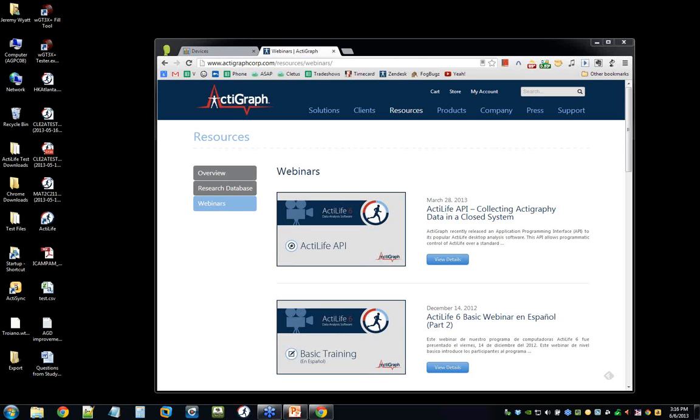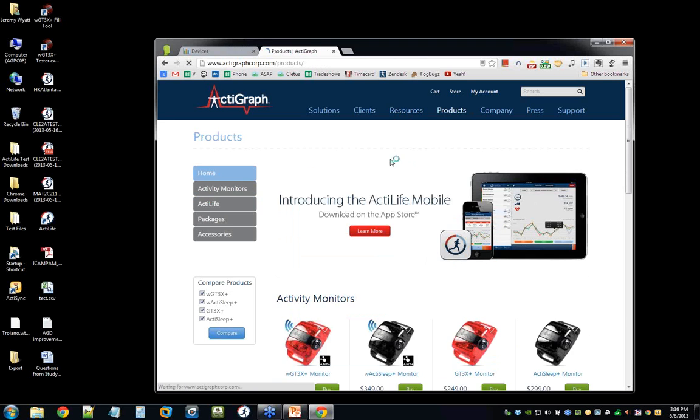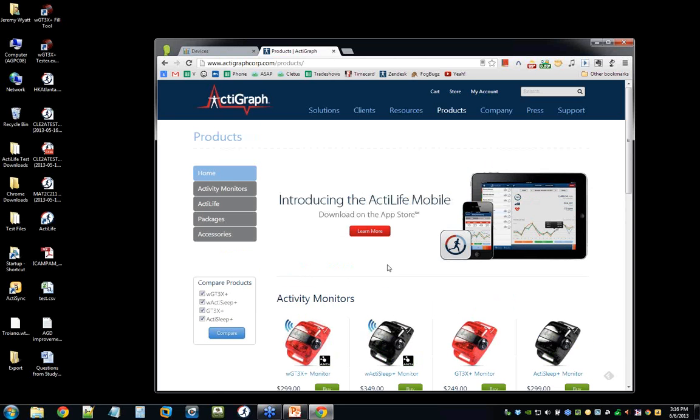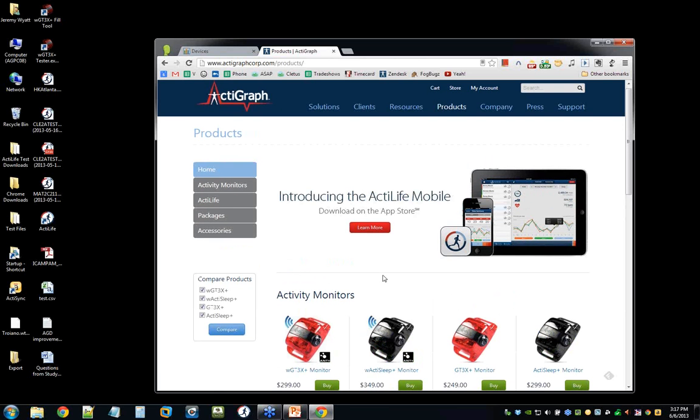I had a question earlier in our first webinar regarding which device should I use. That was a good question that I'd like to come back to and just mention that our GT3X Plus line of devices that you'll see under products here on our website, these Plus devices, are our latest model, and we're just going to continue to build on that model. So anything that has a plus after it is going to be the device that you want to buy if you're looking to collect data. The beautiful thing about these monitors is that they do collect raw data, and we are able to go back and use that data in a lot of different ways.